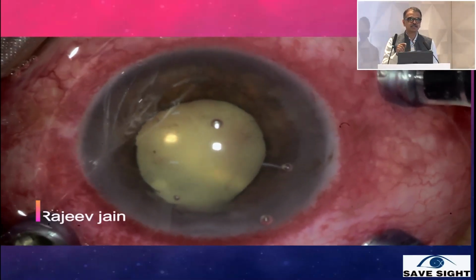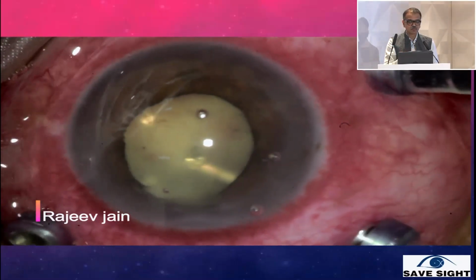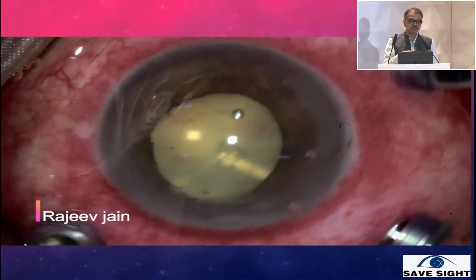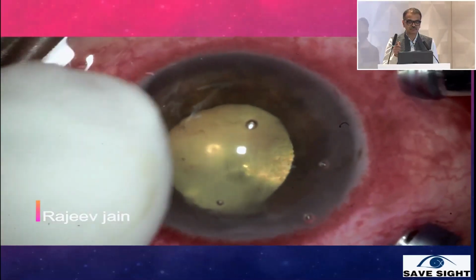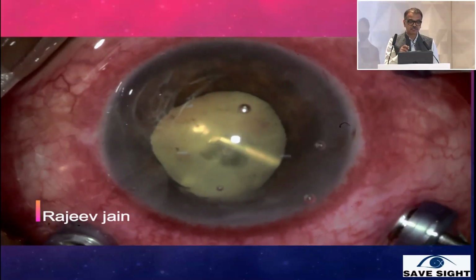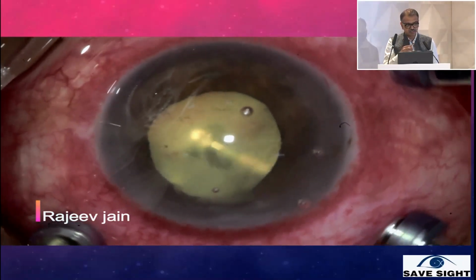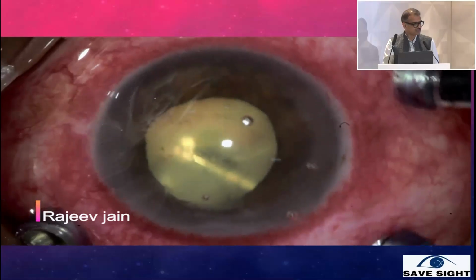We start cutting at a high cut rate, and slowly move from behind the IOL towards the core of the cavity, and then gently aspirate the material which has come into the cutter. We take the cutter outside, and whatever fluid is there in the tube, we take it into the syringe, and then we start the infusion only after this step. After starting the infusion and completing the vitrectomy, we also send the cassette sample for microbiology and staining.